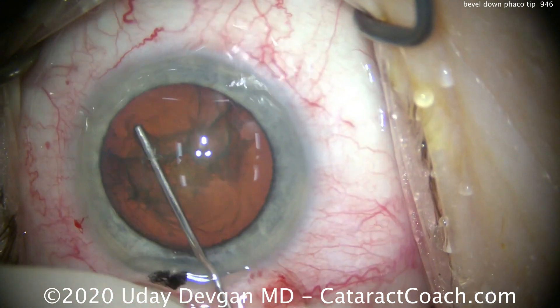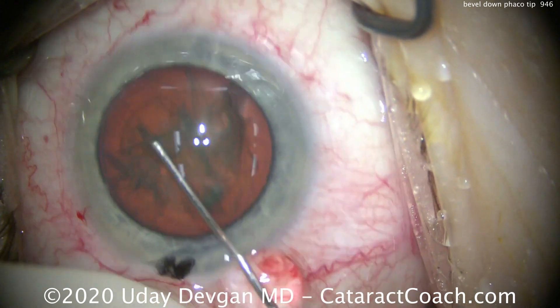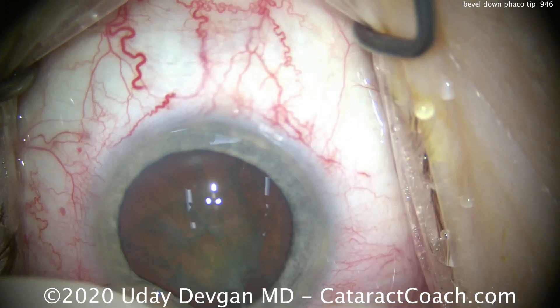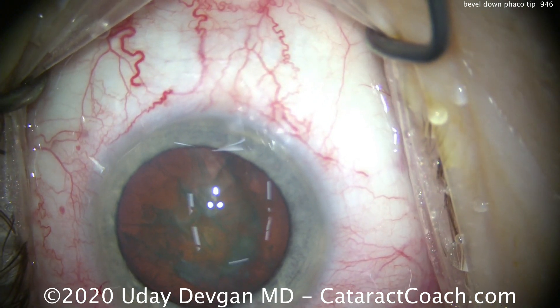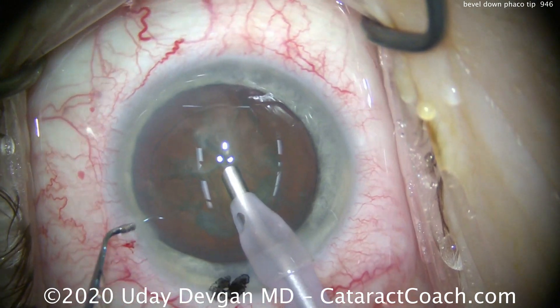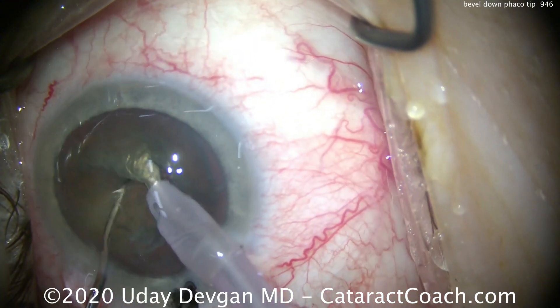You can go bevel up, bevel down, any way you like — whatever makes you happy. But the reason I choose bevel down is because of the fundamentals of phaco chop. The fundamental is you hold the nucleus with the high vacuum of the phaco probe while the chopper divides or splits up the nucleus. To achieve this with a peristaltic pump, you need occlusion. I'll go bevel down and then I can immediately get occlusion of the tip, and therefore build up of high vacuum, and we can chop.